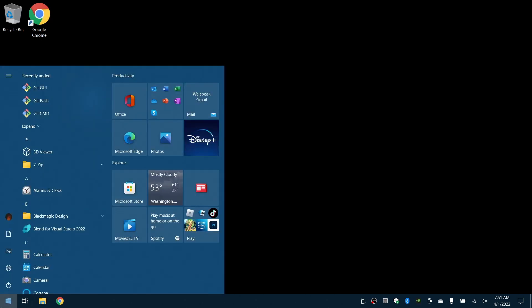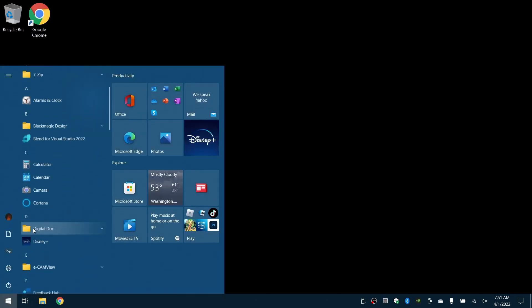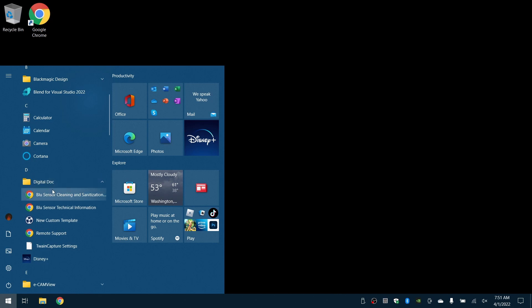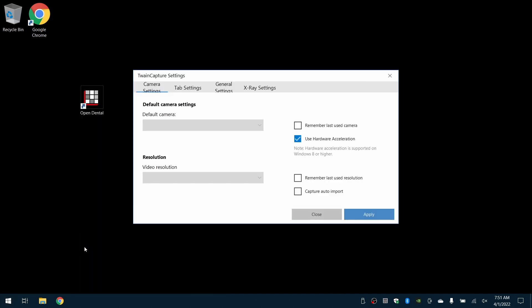Let's set up the Blue Sensor in Open Dental. First, we'll access the Twain Capture settings. Those are available in the Windows Start menu under Digital Doc.